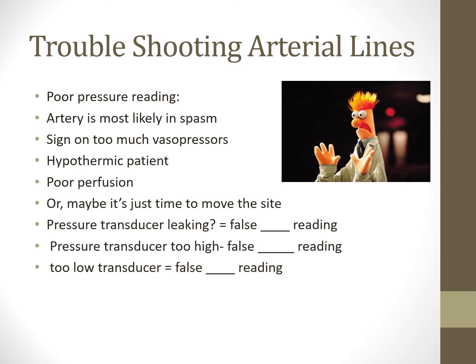If the patient starts to develop signs of an infection, increased white blood cells, fever of unknown origin, and so forth, we might pull all the lines and send them for culture, right? We might pull the central line, we might pull the art line, and send them for culture. Well, if we pull those lines, do we risk the chance of another infection or another insult by putting in another arterial line? Do we still need it?